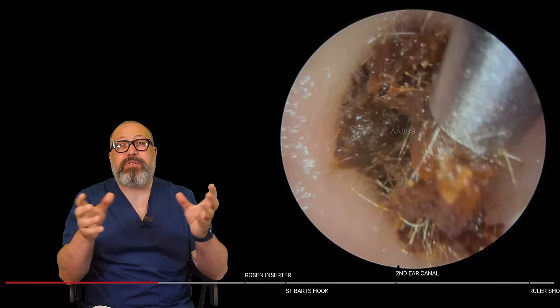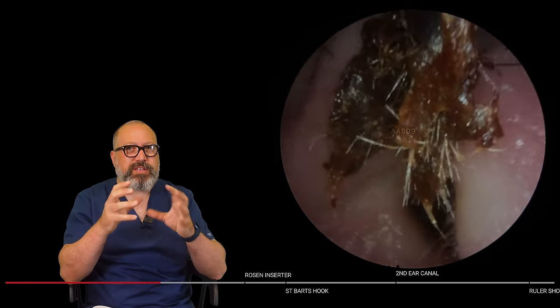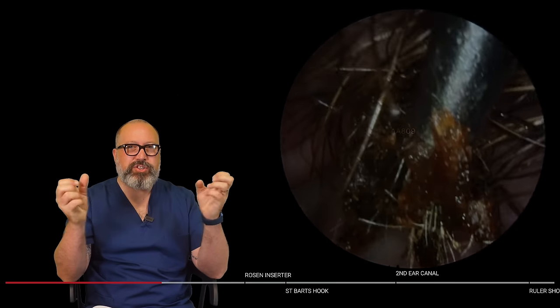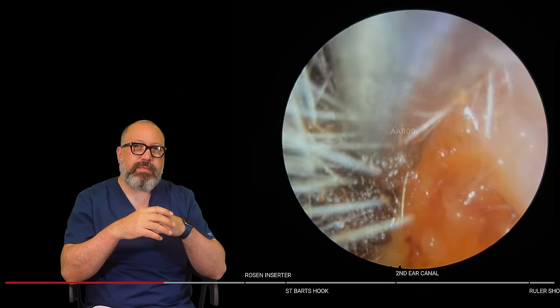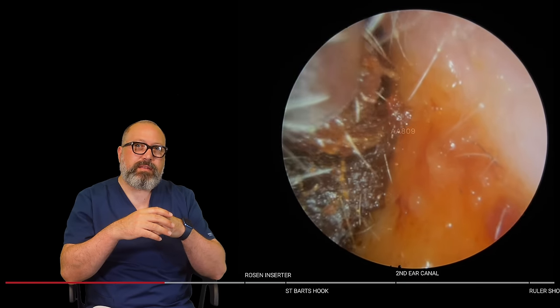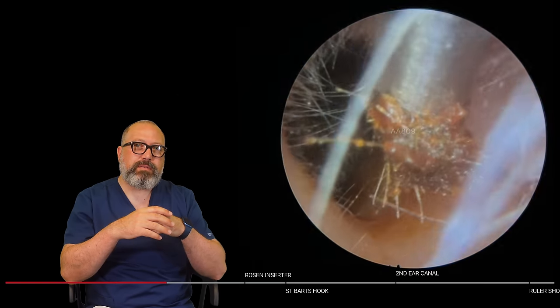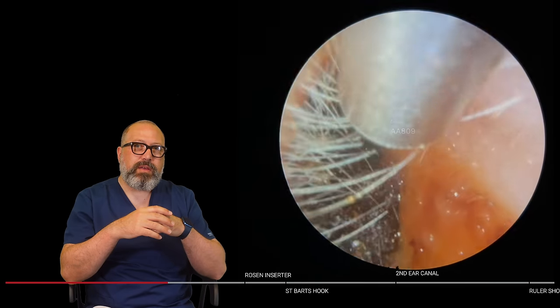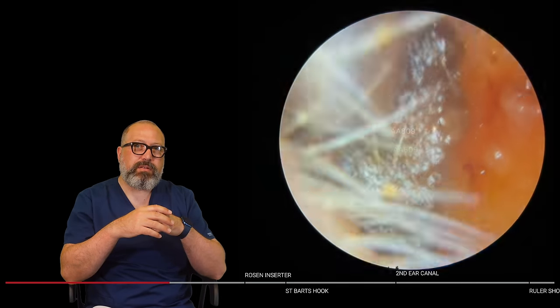There we go. Now you can see that plug breaking down. You can see it wasn't quite solid. It's quite flexible in the middle. So it's all these pieces just starting to stretch out, and because they've got a bit of room, they're starting to come away from each other in there. There we are, it's coming around. There we go. Let's try and lift this section here as well.